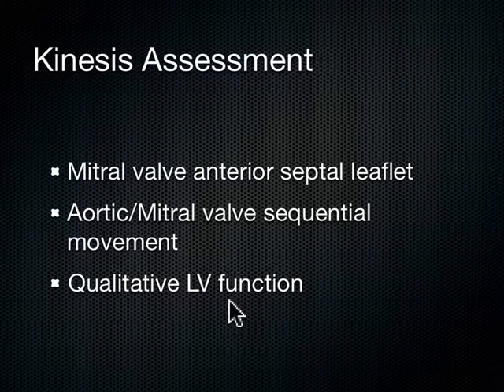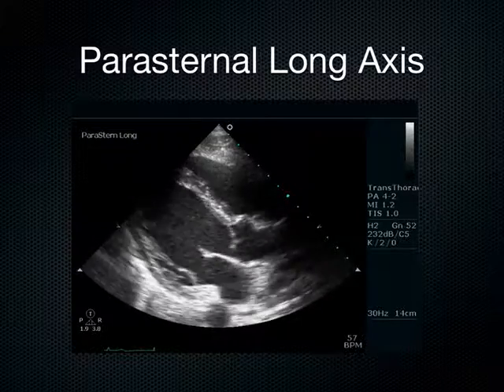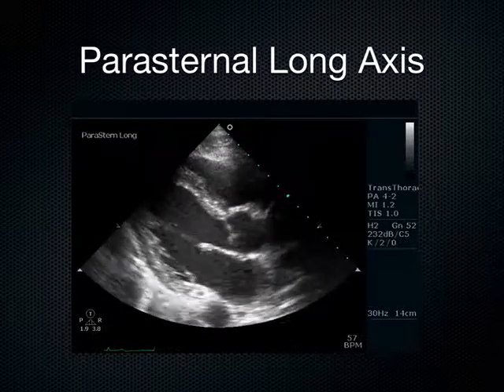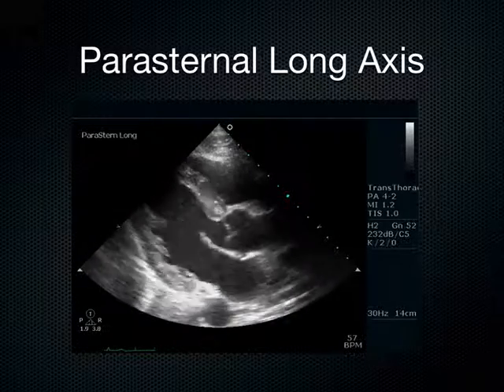I'm going to look at the mitral valve — the anterior septal leaflet of the mitral valve — and how well it comes up and smacks into the septum of the heart. I'm also going to look at the sequentiality of the aortic valve and the mitral valve, how well they work together, and I'm going to look at the LV and how much squeeze is going on. I do this in the parasternal long axis, which is my favorite window of the heart.